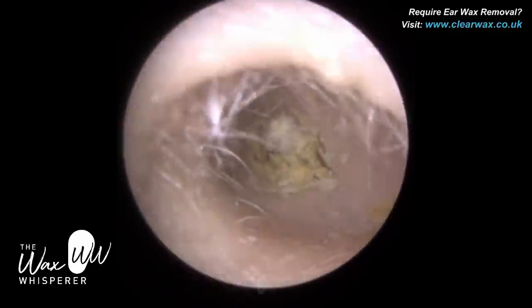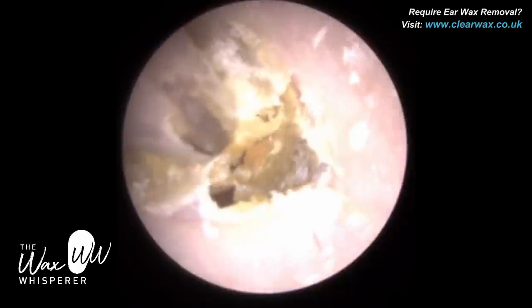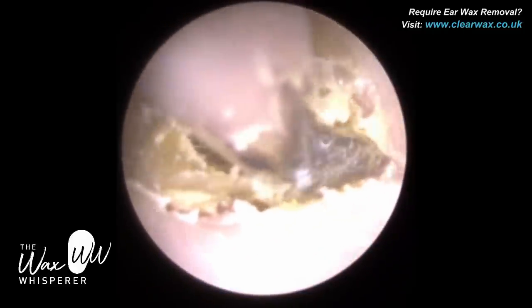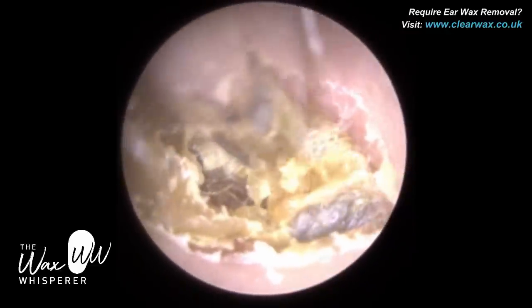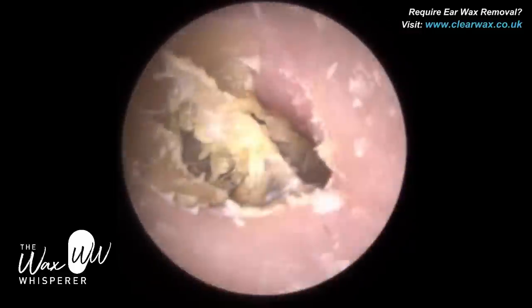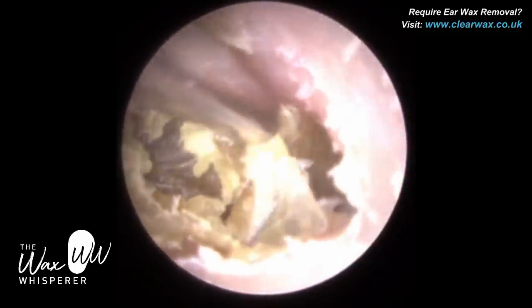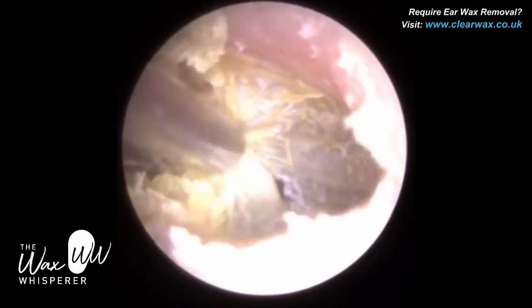We're just on the left side now. This dead keratin is a lot thicker and a lot more adhered, so the fine end wouldn't be strong enough here. I've had to use a standard Zonas suction probe, but we were getting a bit of clarinetting. Clarinetting is when the dead skin violently flaps at the tip of the suction probe and emits a very loud, high frequency squeal. So I've had to stop with the standard probe and revert back to the fine end, but I'm finding it quite difficult peeling this thick layer of skin off the eardrum and the medial ear canal wall — the fine end just isn't strong enough.